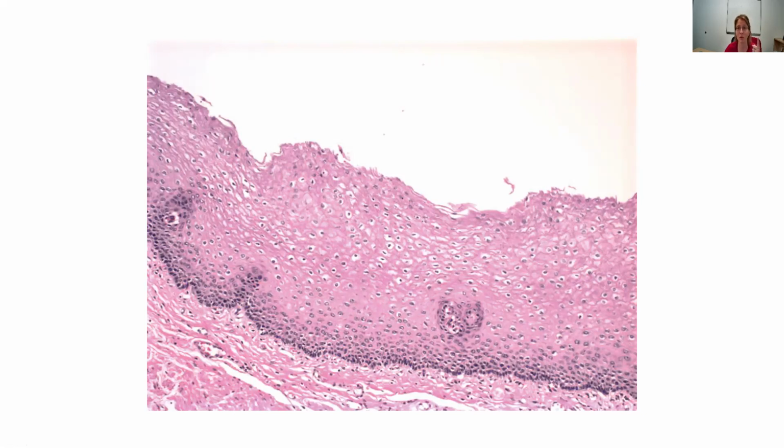Now, do I have one layer of squamous cells or do I have multiple layers of squamous cells? Well, that should be pretty obvious. Even if I can't distinguish specific lines going through, this is multiple rows and groups and layers of squamous cells. All right, so I'm down to epithelium, it's squamous, and it's stratified because I've got all these layers of it. Now, when I get to that point, stratified squamous epithelium, I can go with keratinized or non-keratinized.